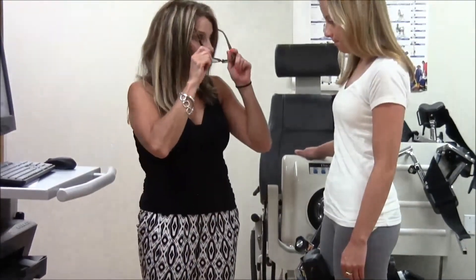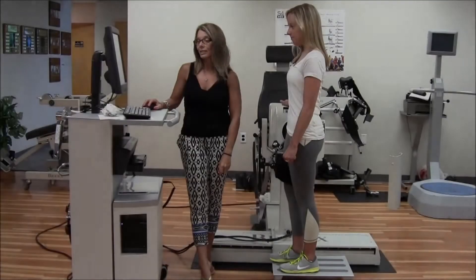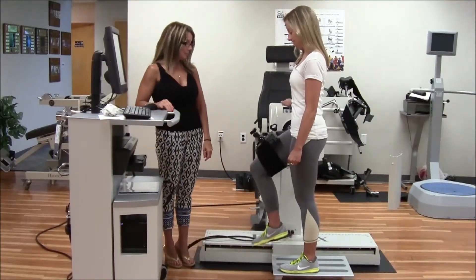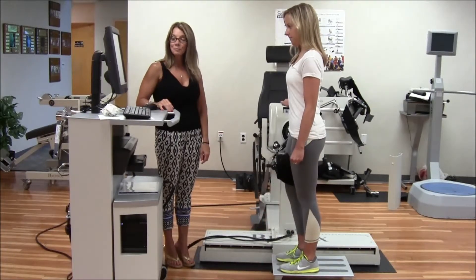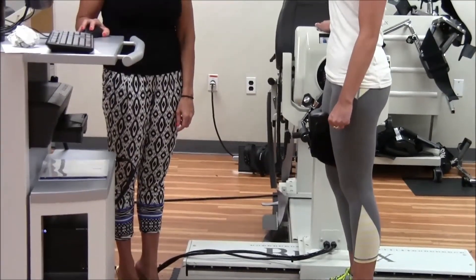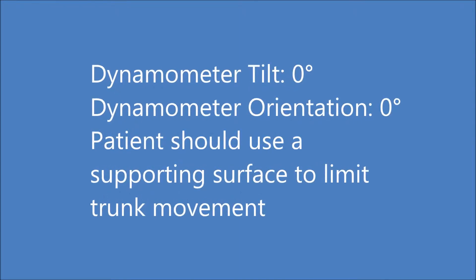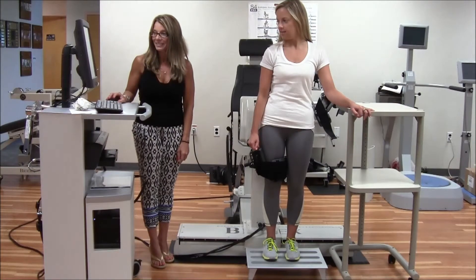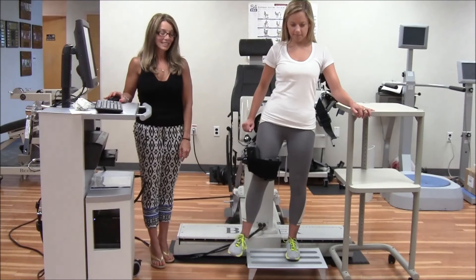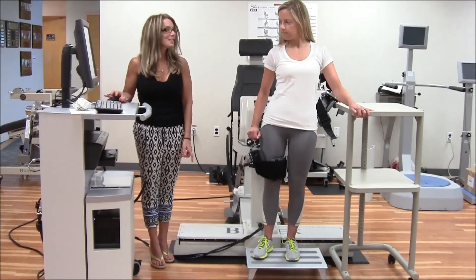The pad is able to swivel. Ready, Megan? And go, Megan. Good job. Ready, Megan? Ready. And go. Right. There we go. Thank you.